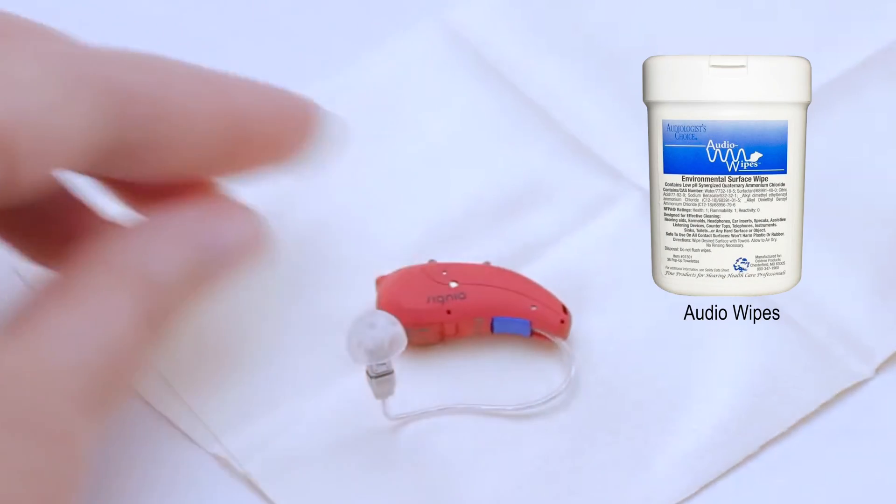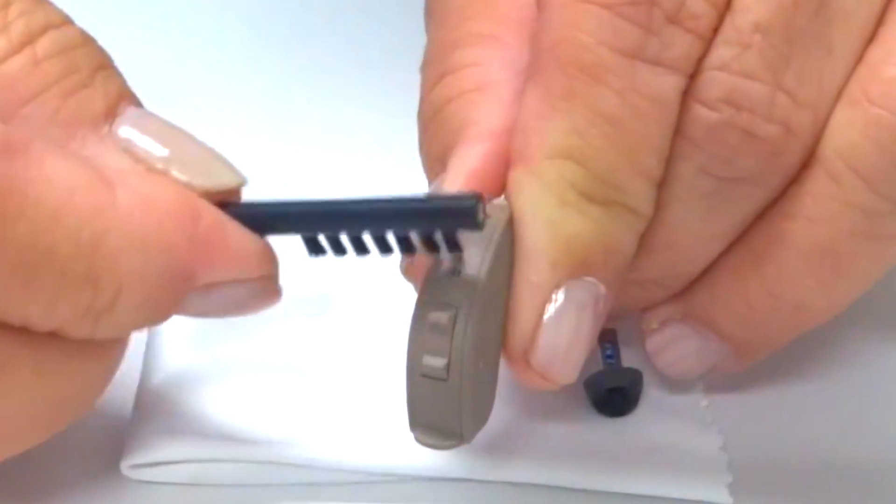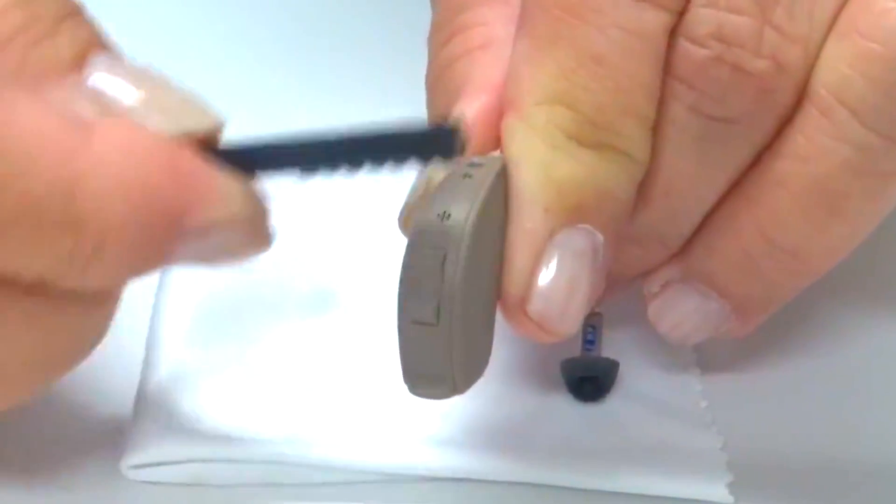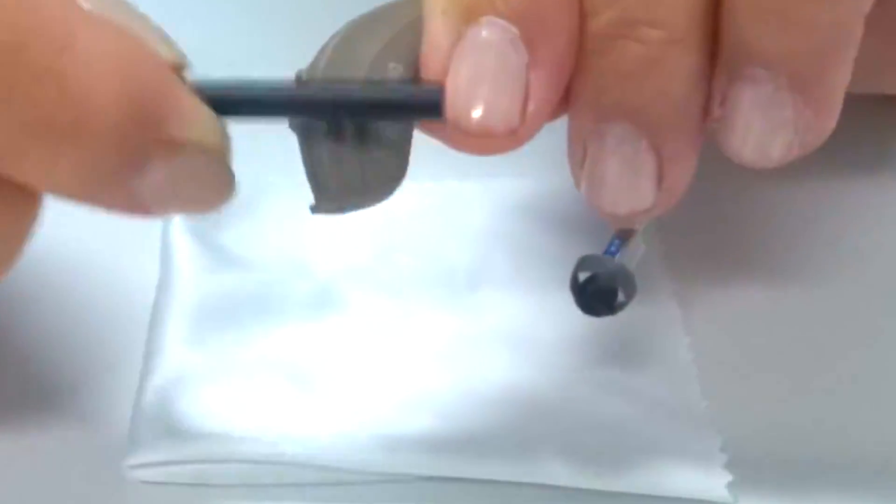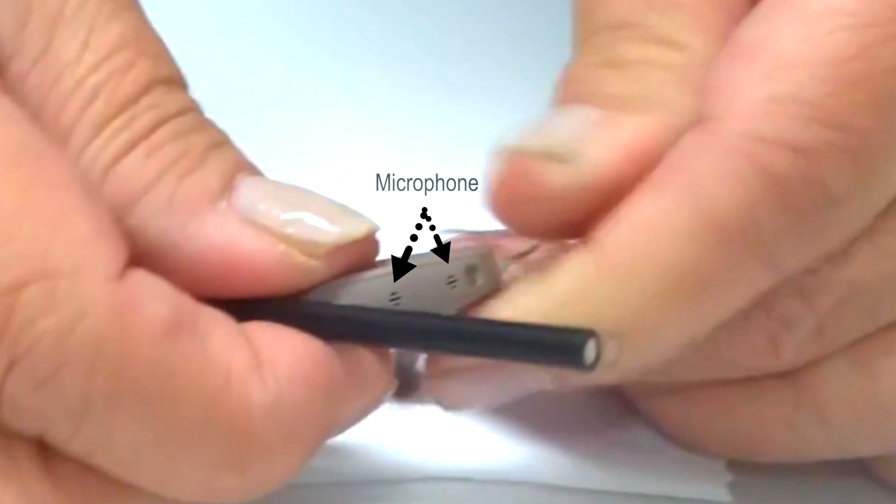If you need something wet, then use audio wipes that are meant for hearing aids. A brush can be used for particularly stubborn areas as demonstrated here. Remove any earwax that may be blocking the microphone openings with the brush as well.